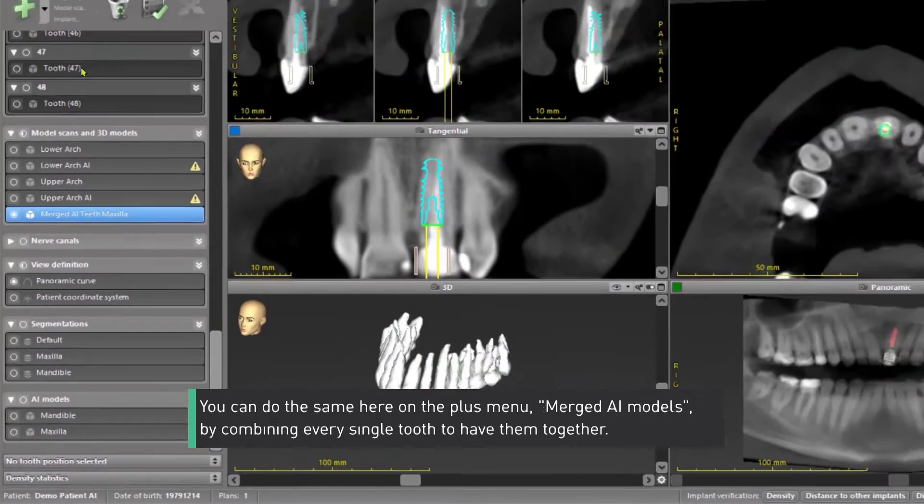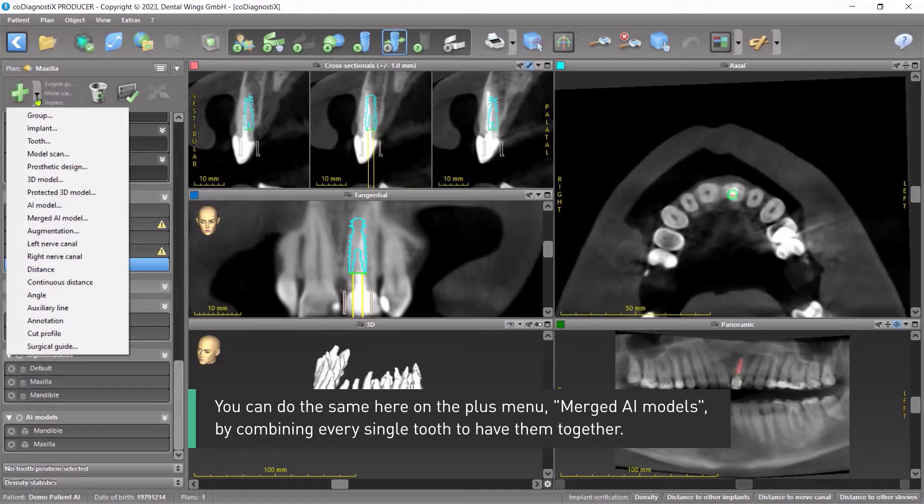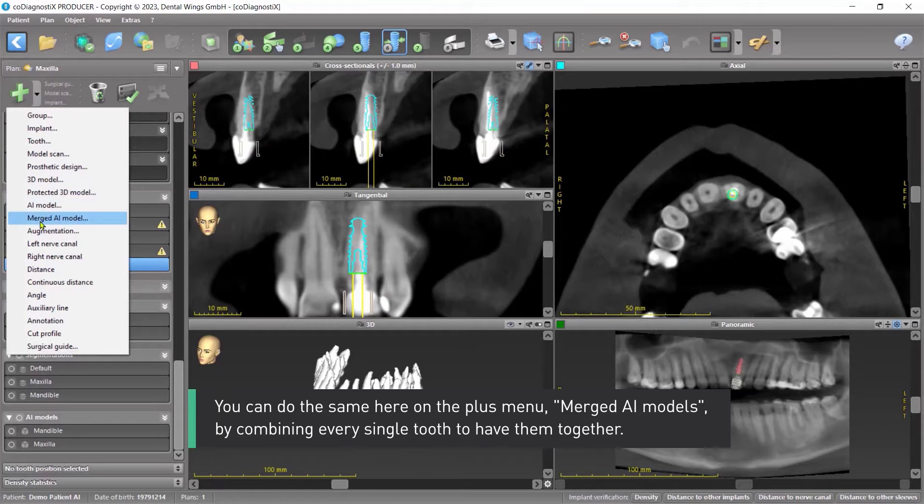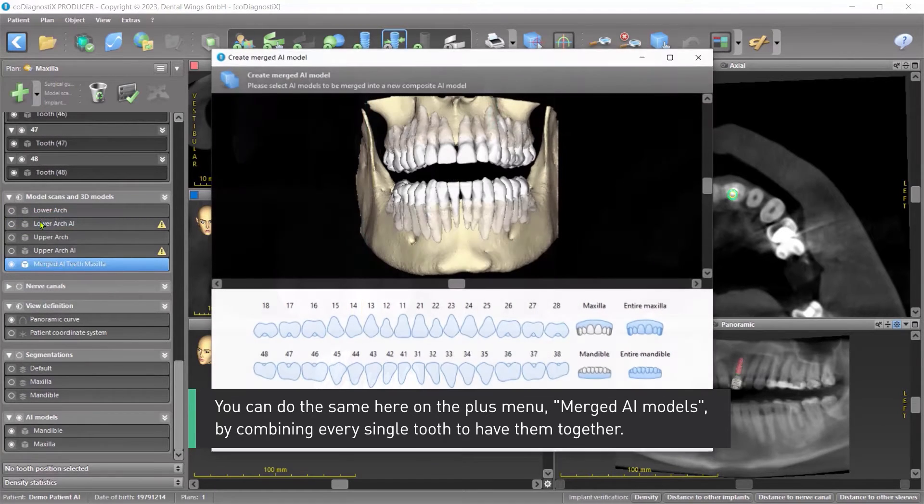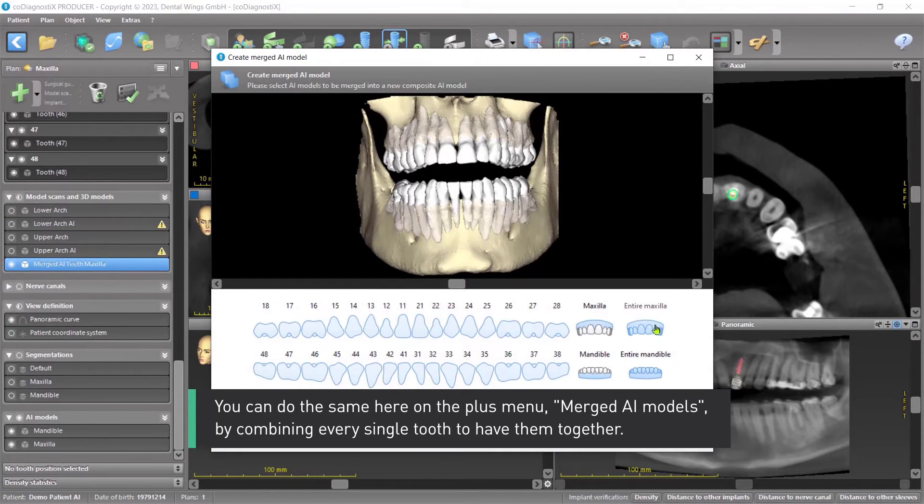You can do the same here on the plus menu Merged AI models by combining every single tooth to have them together.